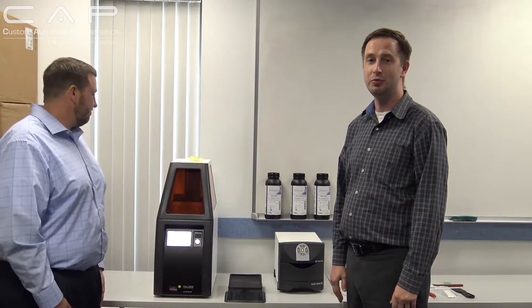Hello and welcome to another edition of What's Going On at CAP. My name is Sam Wainwright. I'm Andy Johnston. Andy's come over from Kulzer here to show us his new printer.